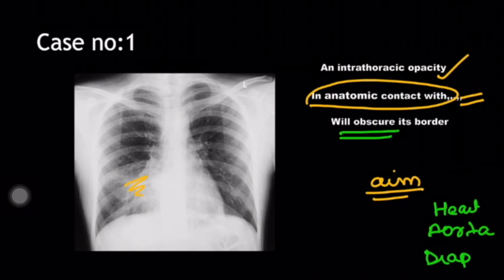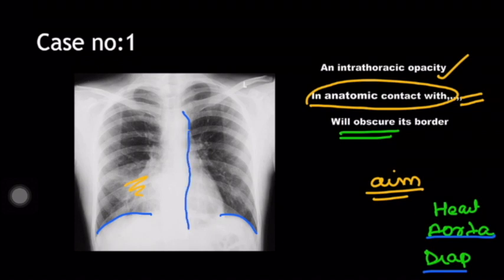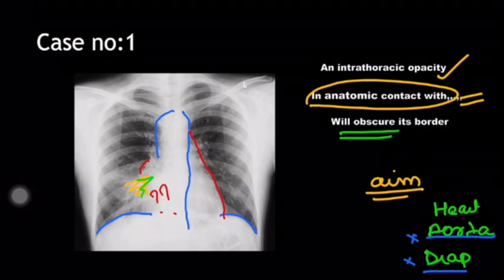Is this opacity obscuring the diaphragm? No — you can see the diaphragm clearly on either side. What about the aorta? This is the aortic knuckle, you have the descending aortic line here. Ascending aorta will be somewhere here because we know ascending aorta forms the right upper heart border. So the aorta is also not obscured. What is remaining? The heart. You can see the left heart border — it's clear. But the right heart border is not clearly seen, so the lesion is obscuring the right cardiac border.